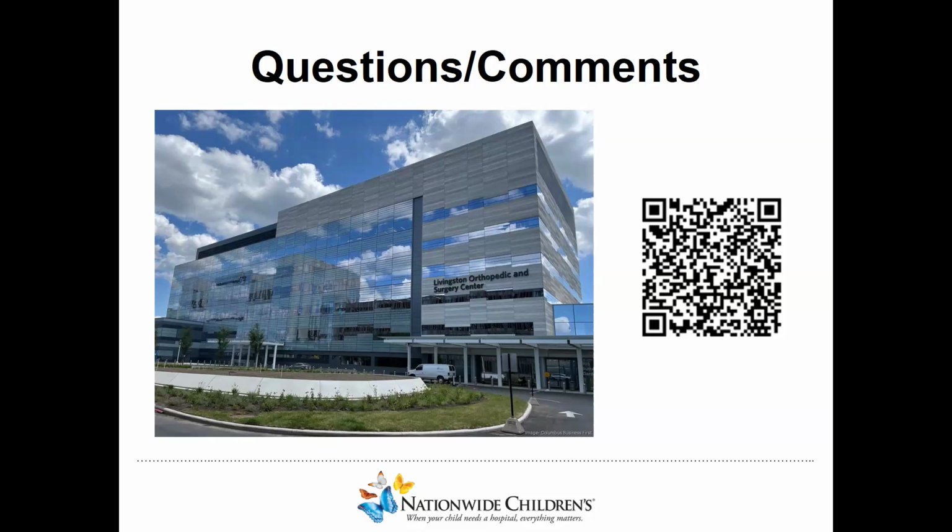With specific regard to MPFL injuries and some clinical pearls, as you had mentioned, typically that is going to be most injured along the medial femoral condyle, where that ligament attaches at its origin, but it can be injured less frequently at the patella itself. Some of the things you already demonstrated with your images are the secondary signs. If you're ever seeing a suprapatellar recess effusion, I'd have a very heightened awareness that you're more than likely going to have an MPFL tear if they have that history of a patellar subluxation or dislocation.